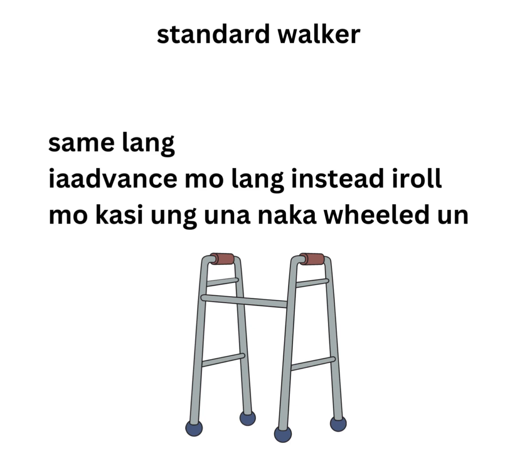Wheeled walker po yung kanina. So, this one is a standard walker naman. Same lang naman siya. I-advance mo lang siya instead of i-roll kasi naka-wheeled po yung nauna.